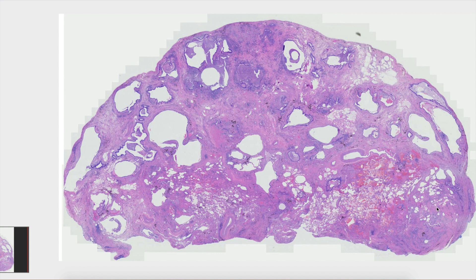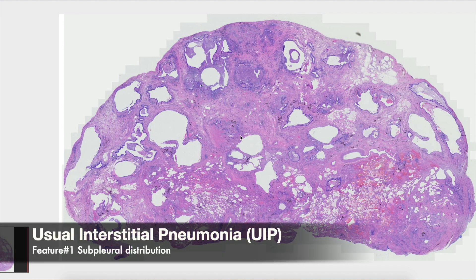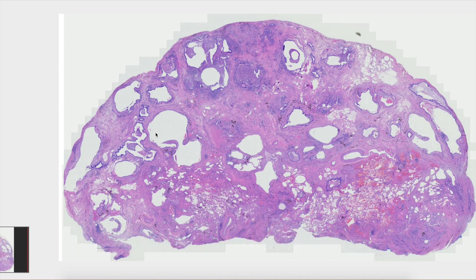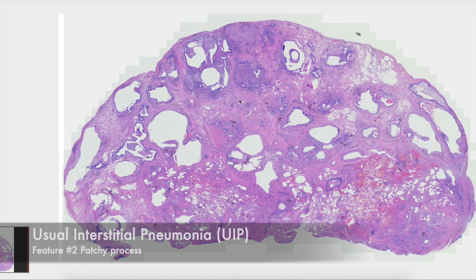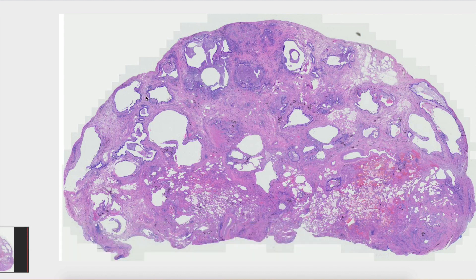We would call this distribution a sub-pleural distribution. This is also a patchy process where we have these diffusely abnormal areas with fibrosis and architectural distortion alongside relatively normal areas of uninvolved lung.